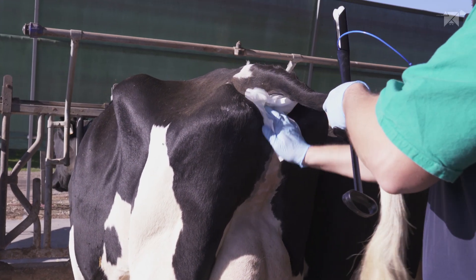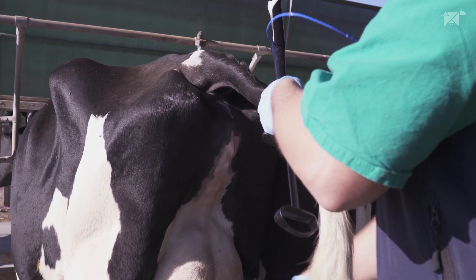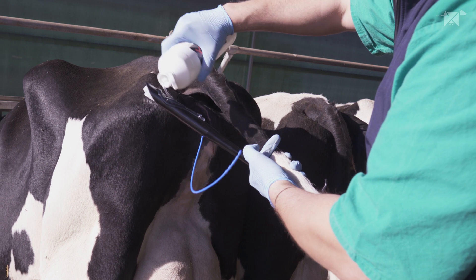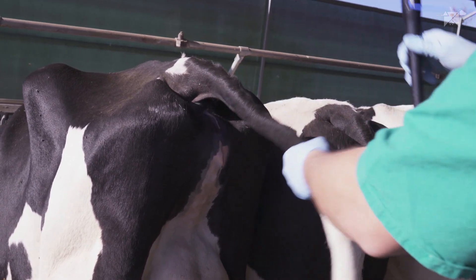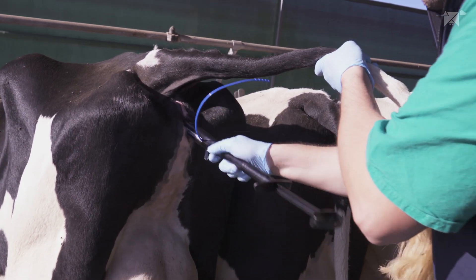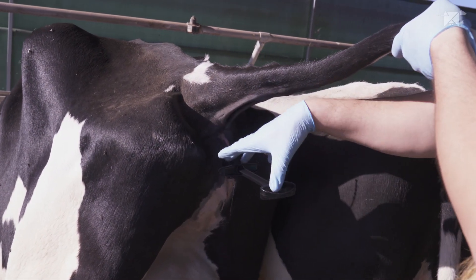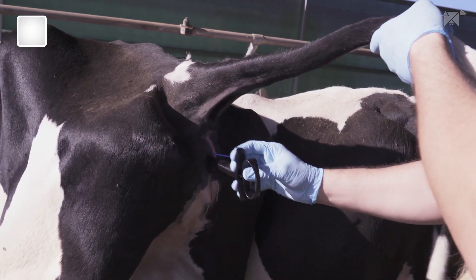We're going to start cleaning the vulva. Then apply the obstetrical lubricant. Next, rotate and then release.